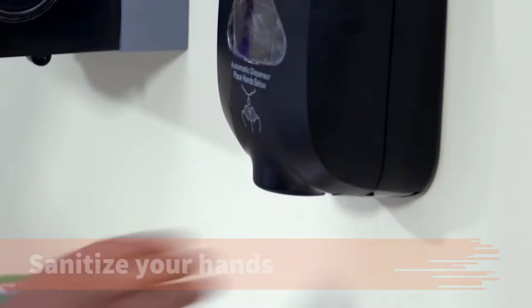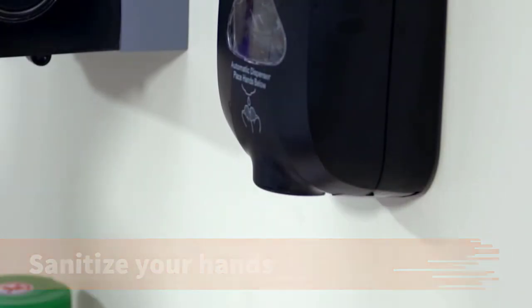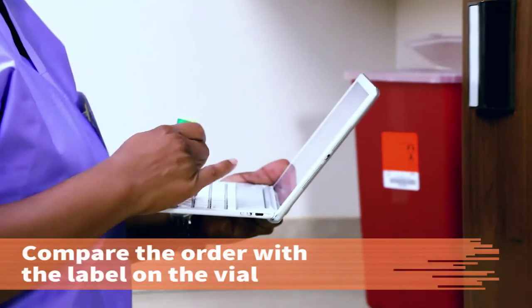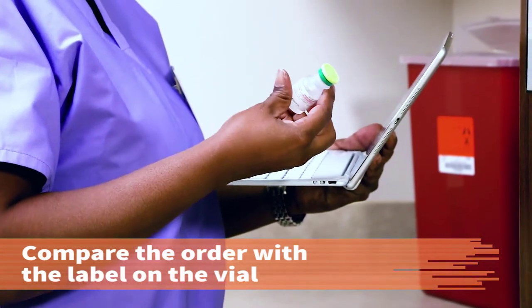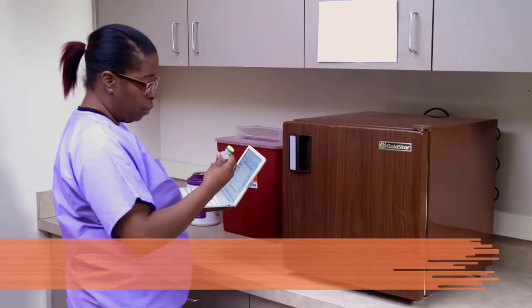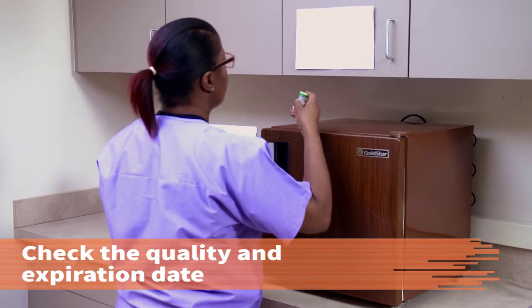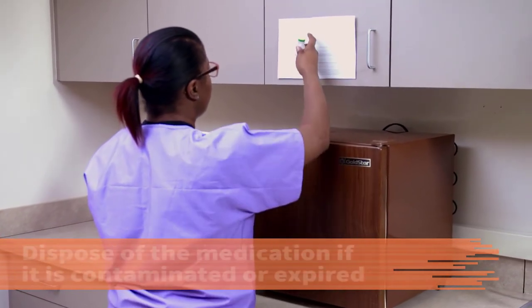Before you dispense the medication, sanitize your hands. Compare the order with the label on the vial of medication when you remove it from storage. Check the quality of the medication and the expiration date on the container.